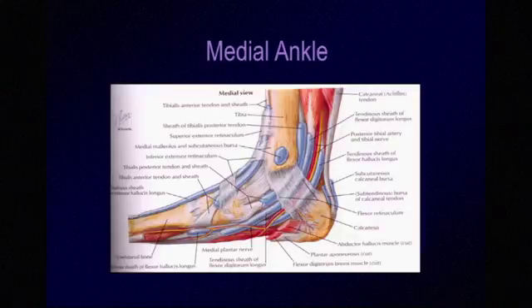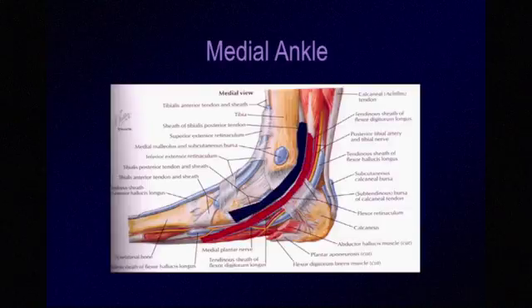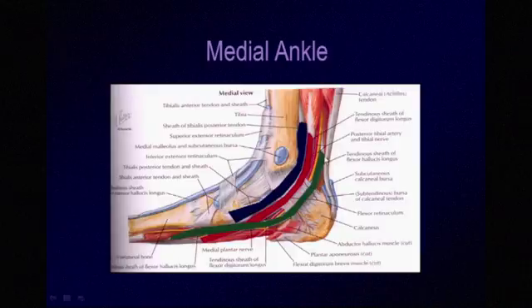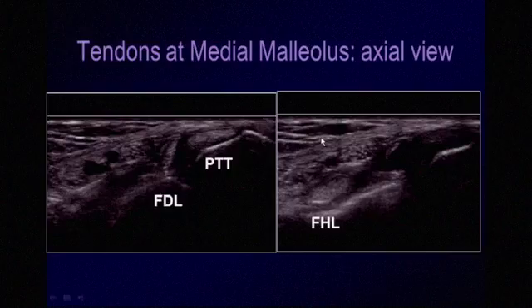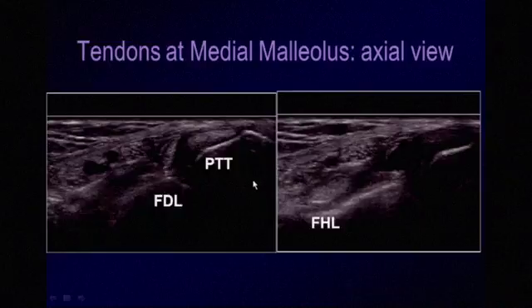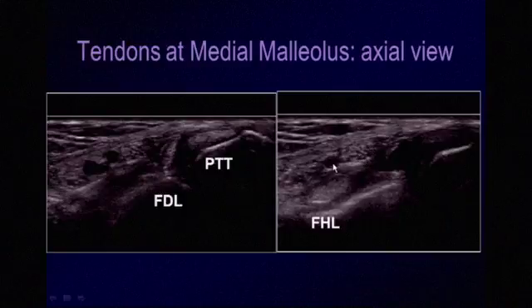Moving on to the medial ankle, we are looking at three tendons: the tibialis posterior tendon outlined in blue, the flexor digitorum longus tendon in red, and the flexor hallucis longus tendon in green. Between the digitorum and hallucis longus tendons are structures traveling within the tarsal tunnel, covered by the flexor retinaculum — the posterior tibial artery and veins, as well as the tibial nerve. On the axial view, we see the tibialis posterior tendon against the medial malleolus, adjacent to the flexor digitorum longus, with the tibial nerve and posterior tibial artery and veins visible in between.